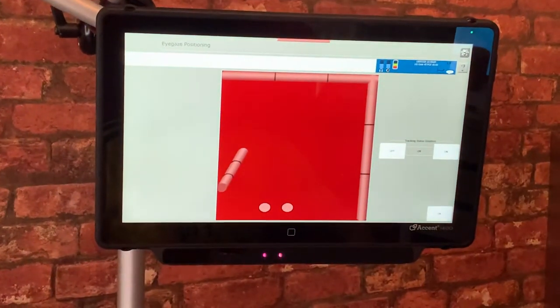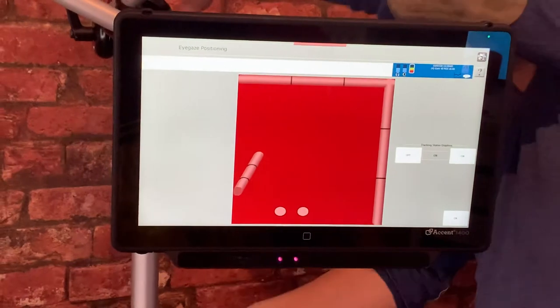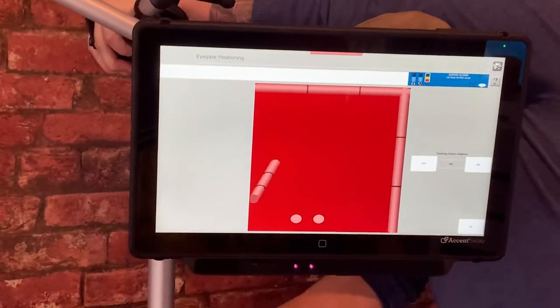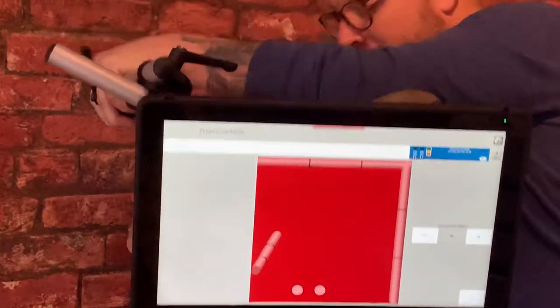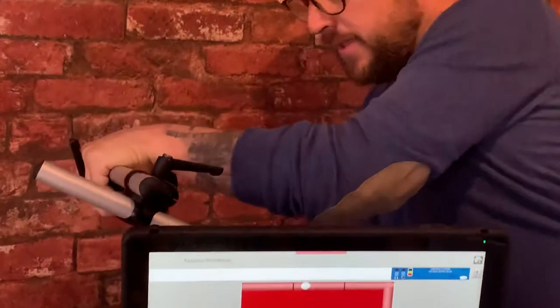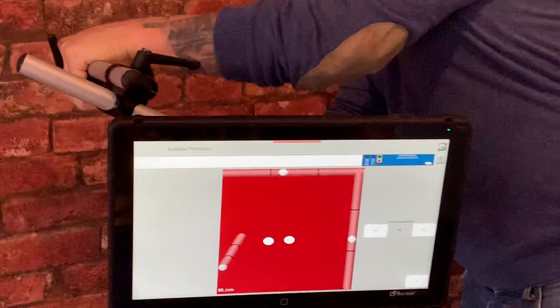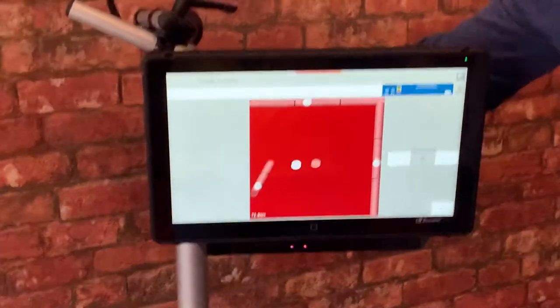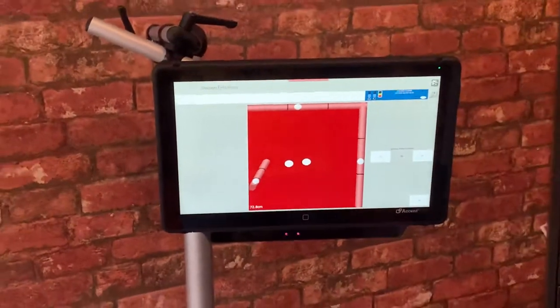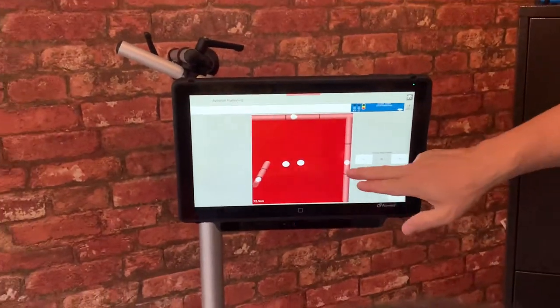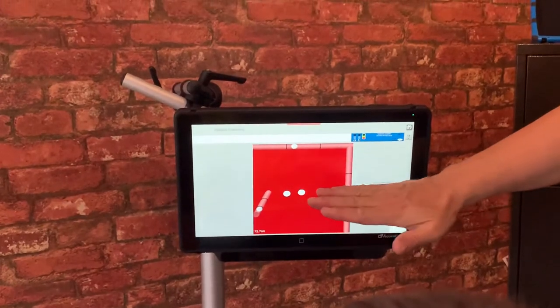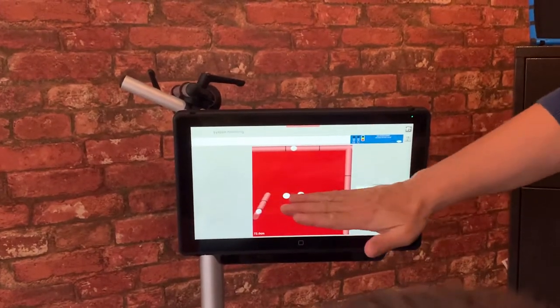Now I can see that the client is not focused on the device so I'm going to bring the device down slightly and then I'm going to make some adjustments. So already I can see that I've brought it down enough so the position and height is correct.